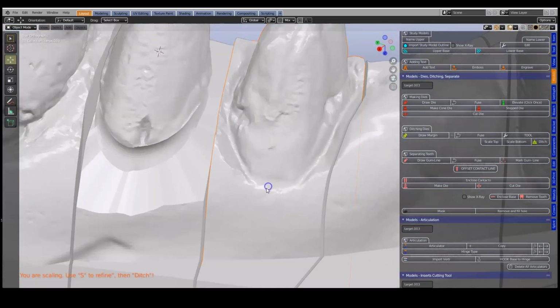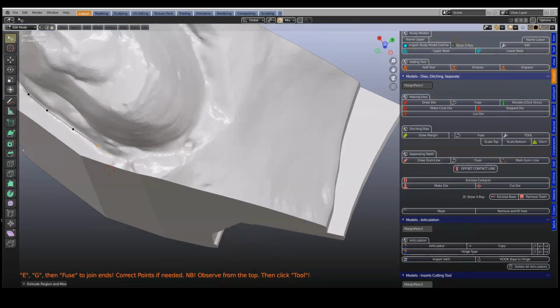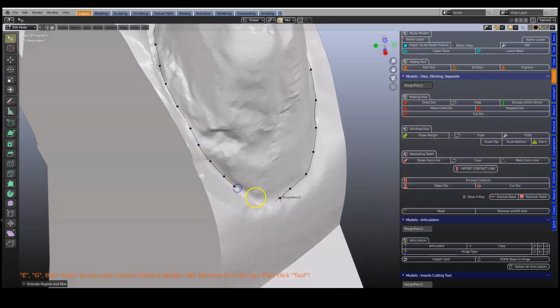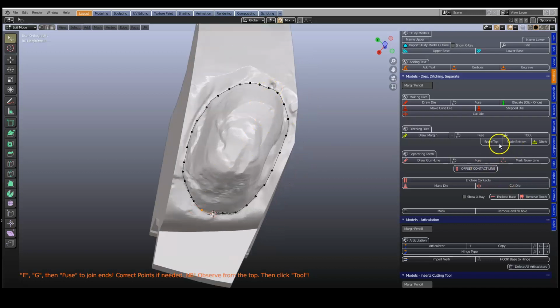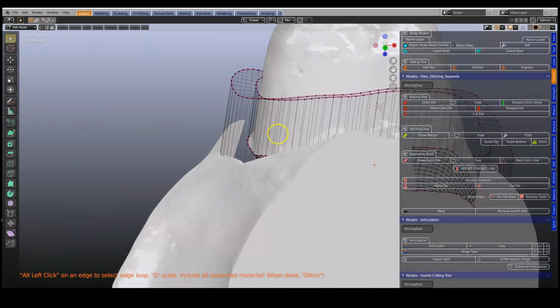This is the next one. So shift right click, draw margin, E to extrude all the way. So this is actually quite a fun case to do. Okay, so there we've got a bit of stuff happening here that I don't like. Okay, this is looking good. Up to there. Tilt it nicely, like something like that. I must be careful there. Okay, tool. So I'm just checking, it's like very, very close here. So I want to make sure it's not trimming my prep.